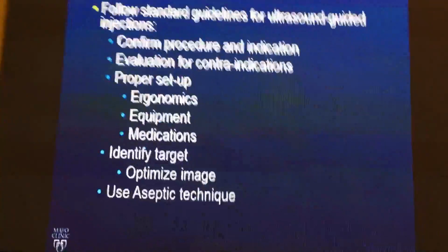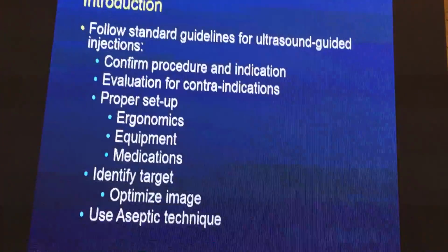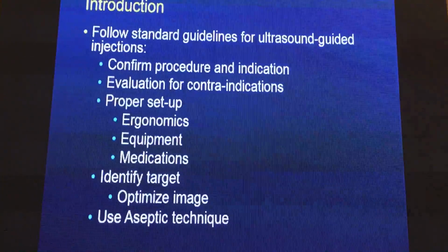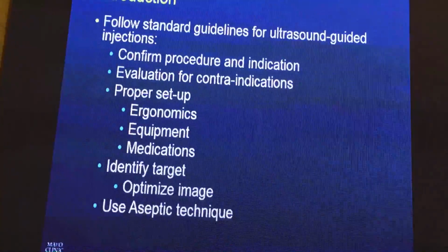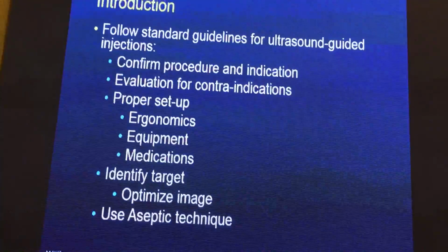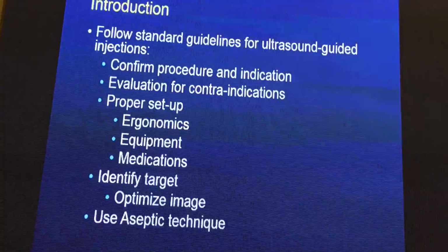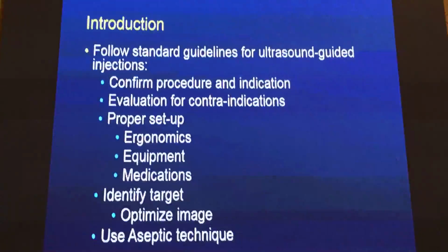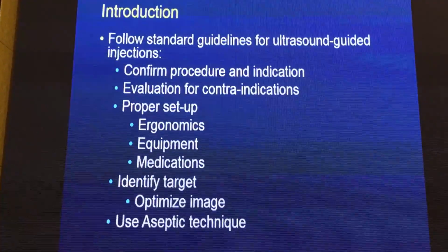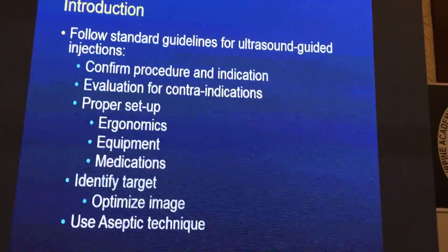So, different contraindications. Ergonomics is really important. I always tell people doing ultrasound guided procedures is like trying to put a credit card over the top of a needle. You have this teeny little thin beam. And if you're looking behind you at the screen, you've got your shot going on over here and the person's uncomfortable and so they're wiggling around, you're not going to be able to do it. Your neck's going to hurt. You can't keep your transducer over your needle. Make sure they're comfortable. Make sure you're comfortable. Have everything set up ergonomically.